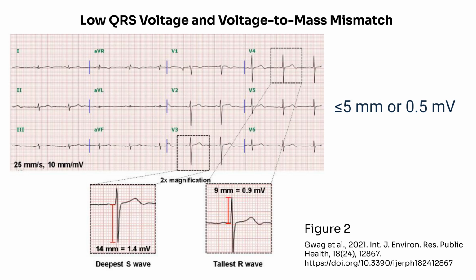In most hypertrophic conditions, like hypertrophic cardiomyopathy, thickened ventricular walls generate high QRS voltages. But in ATTR-CM, you may see normal or increased wall thickness on imaging, yet paradoxically low voltage on ECG. This mismatch is not due to true hypertrophy, but rather to amyloid infiltration, which insulates the myocardium and disrupts electrical conduction.